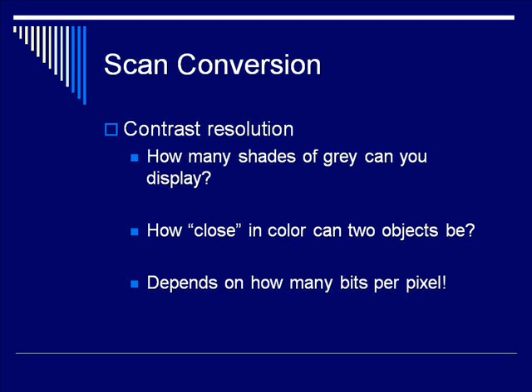Those are the two most common, and if you just memorize those two numbers, you'll probably be okay for the ARDMS exam. However, remembering the general case, that it's the number of bits, 2 to the power of the number of bits, that gives you the number of shades of gray. That would be ideal.